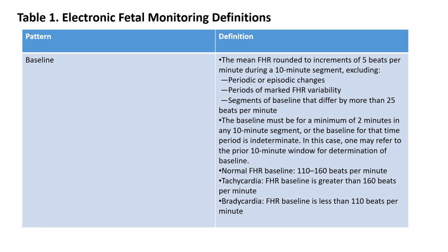So the baseline is not stable in the fetus, which is normal due to the fighting between the parasympathetic and sympathetic nervous system, which are not mature in the fetus. The normal baseline is about 110 to 160 beats per minute.